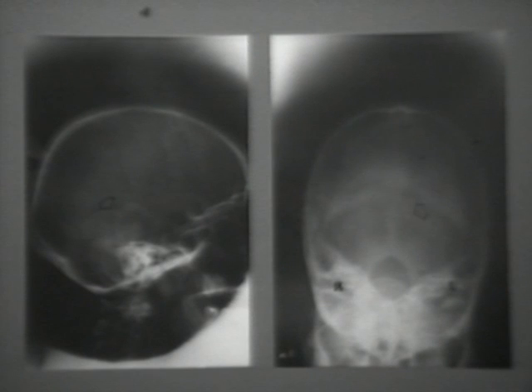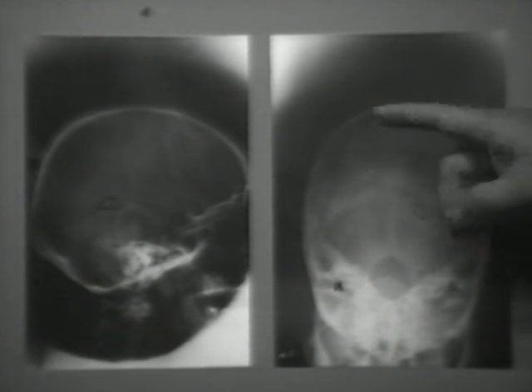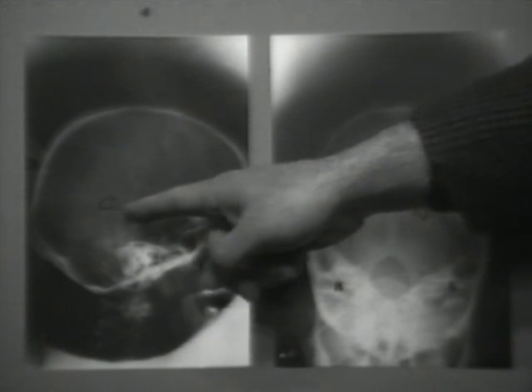Skull radiographs show us the bony structures in various projections, but give us no indication of the soft tissue structures contained within. The conventional system of X-ray source, object, and sensitive film ensures that all the information relating to differential absorption along the path of the X-ray beam will be superimposed on a particular place on the film. The dense bony confines of the skull therefore have a blanketing effect, and we get little or no indication of the intracranial anatomy. We may be restricted to seeing only the displaced pineal body when it is calcified.